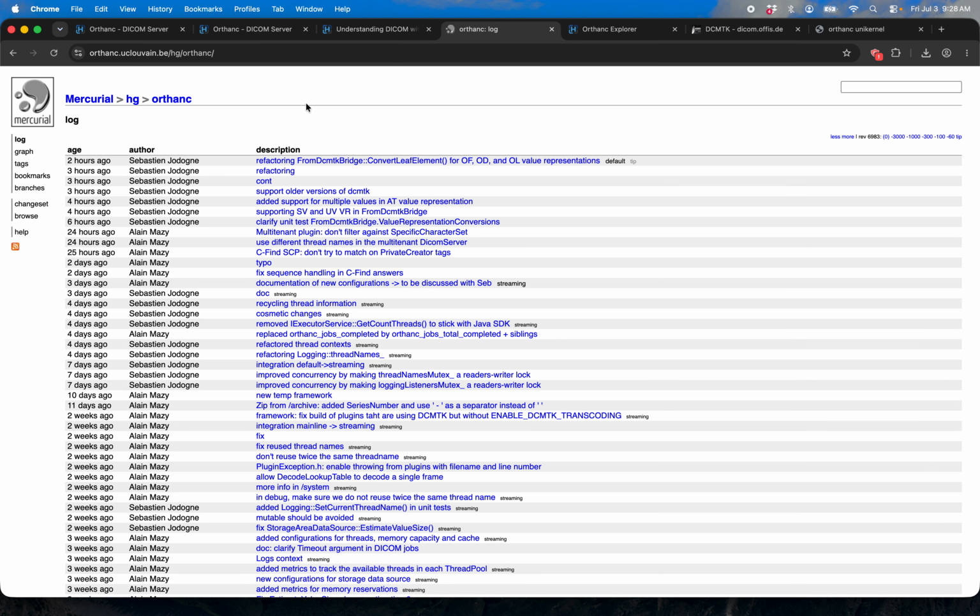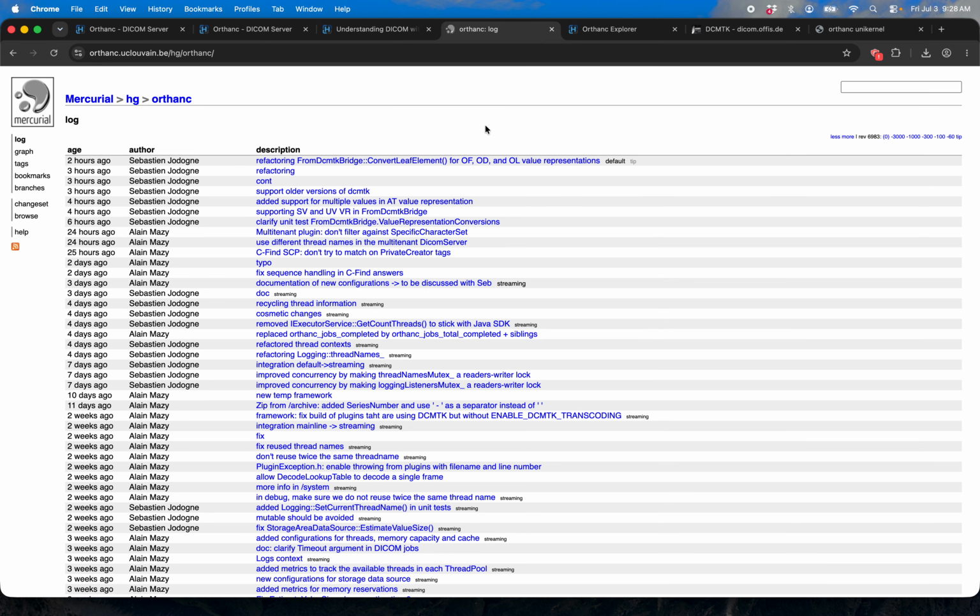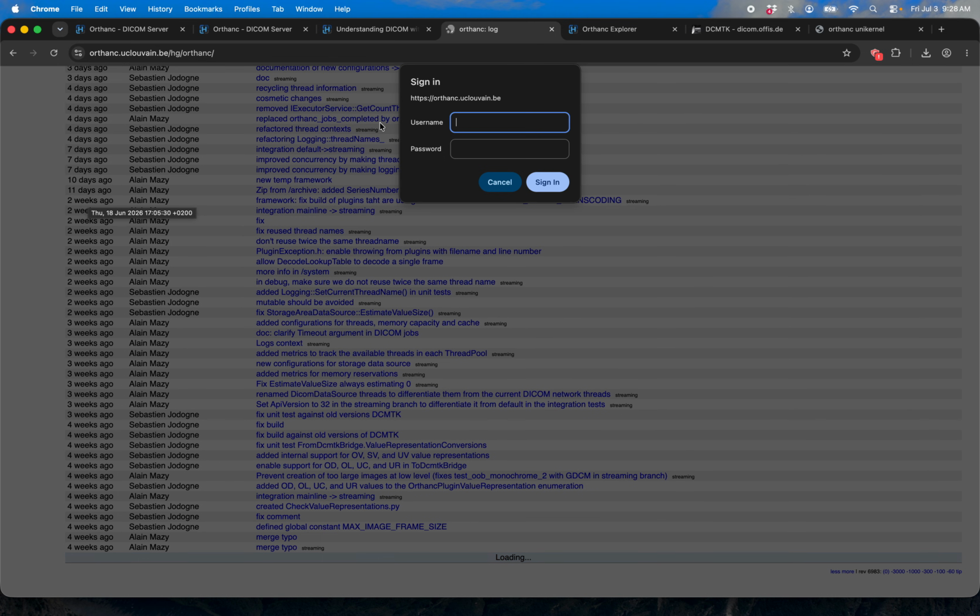This is where they actually host. They're not on GitHub. They're on this Mercurial instance. So as you can see, it's fairly active. Even as I'm writing this, they're making changes as of today. So I don't know why it keeps popping that up.